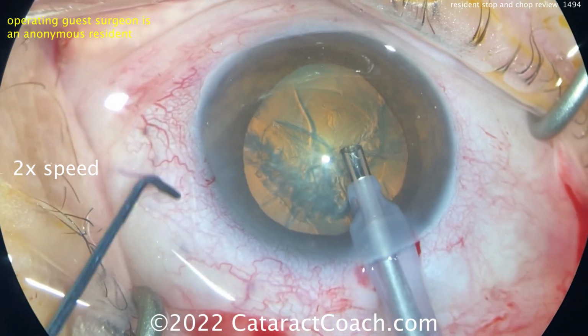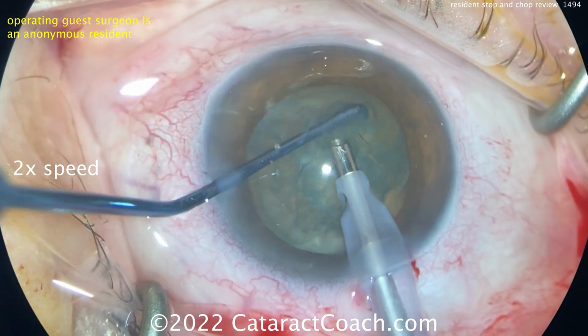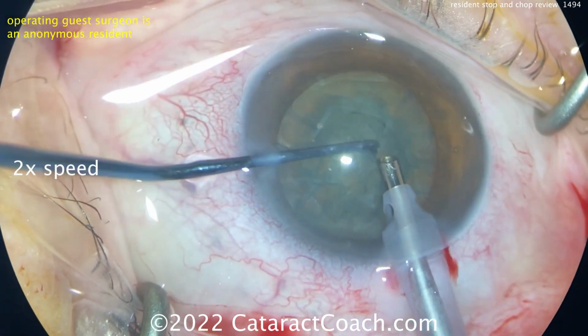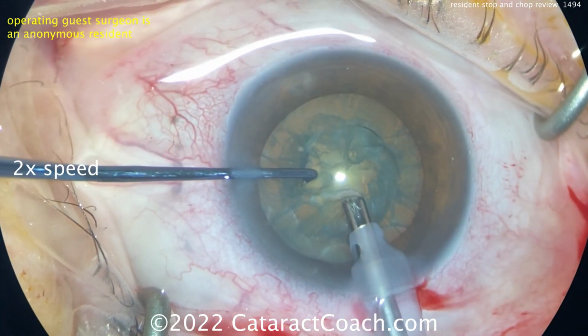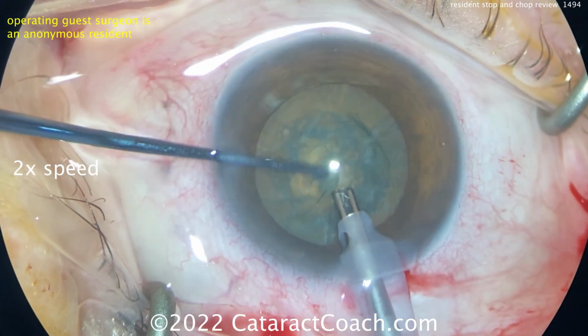Looks like this resident's very smart, using an adapter to mount the cellular phone camera to the oculars of the scope, maybe the assistant scope. And that looks really good. That's a reasonable cataract. Looks like a little on the soft side. So let's see the stop and chop technique here.